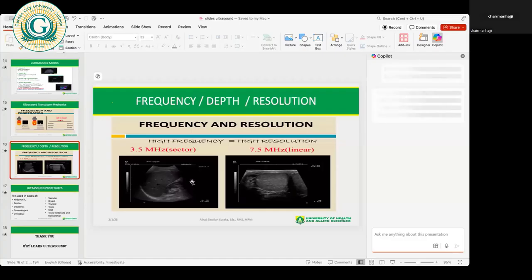In this particular image, you have at the top here, the skin, subcutaneous tissue, rectus abdominis muscle, and then the peritoneum, all lumped up in this small structure here. Okay, because this structure you are seeing here is the liver. So above it are structures that lead from the liver all the way to the skin of the body. That is a lot. But you can see that it is not resolved because they are not distinct. You cannot see all of them different, because the frequency is low.